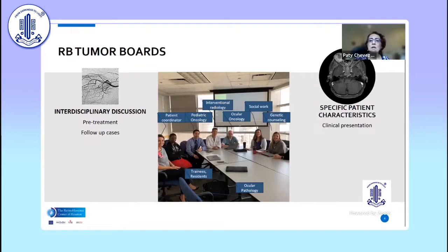From the clinical point of view, since we are in these meetings, we will know exactly the clinical presentation. Is this a typical presentation, an atypical presentation, primary versus secondary enucleation? What should I look for when the patients are already treated? Is this unilateral, bilateral?